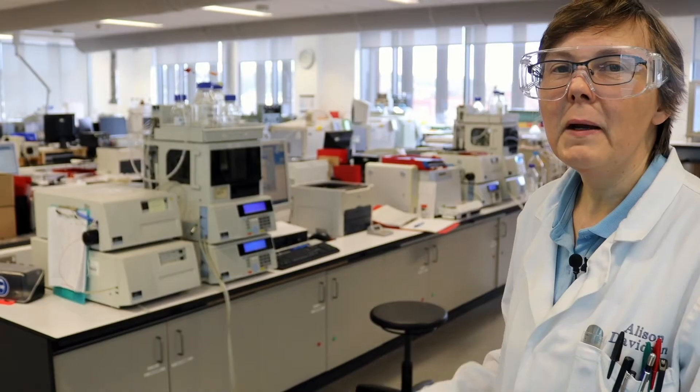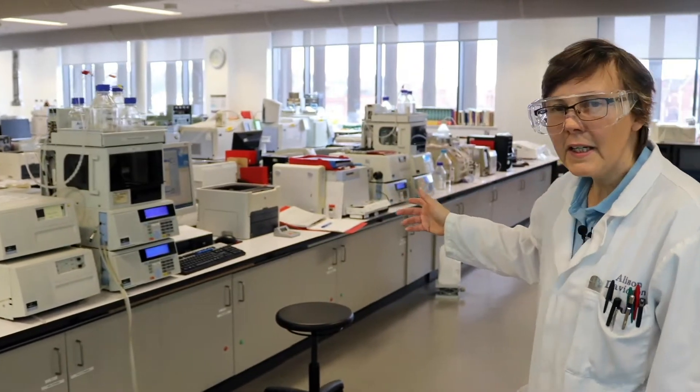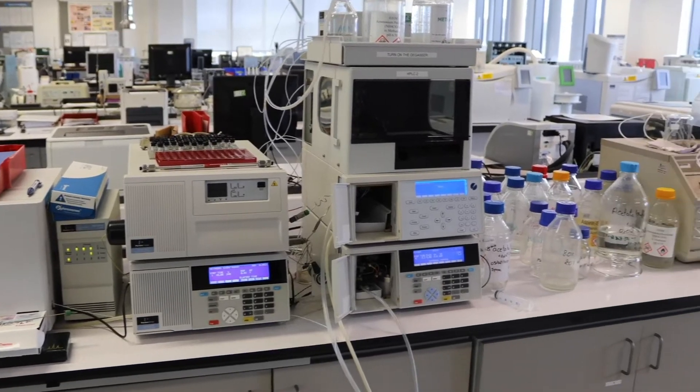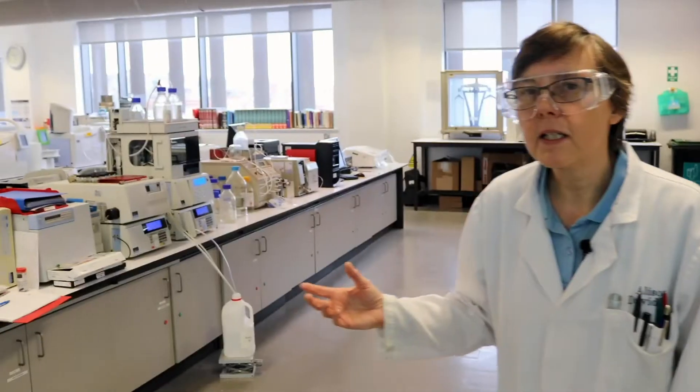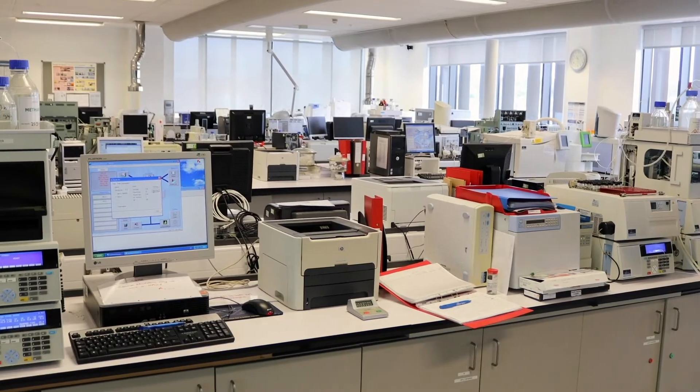I'll just give you a quick tour and then we'll look at some of the specific instruments you'll start with. These are our liquid chromatographs — they're really good for drugs analysis but also all sorts of biological samples.